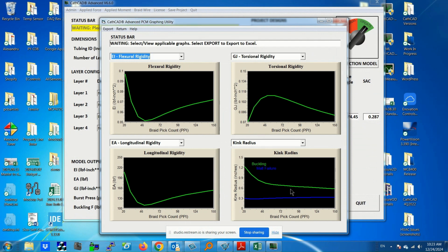The other thing that you'll see that's interesting, again, is kink radius. A lot of times you'll hear the concept that as pick count goes up, the kink radius gets smaller. And again, that's holding true here. And just for everybody's knowledge, we actually calculate 2 kink radius values. One is buckling, which is similar to Euler buckling, but this applies to a tube. And then there's also a failure mode where you'll fail a tube for a kink radius in a material failure aspect. So we actually calculate both values for the user to use. Okay.